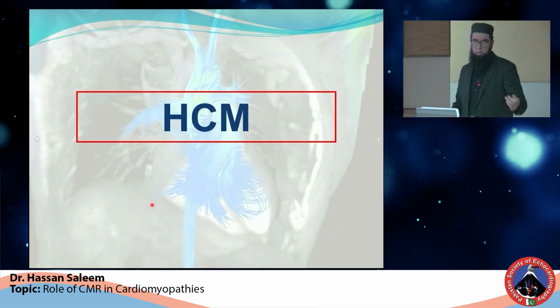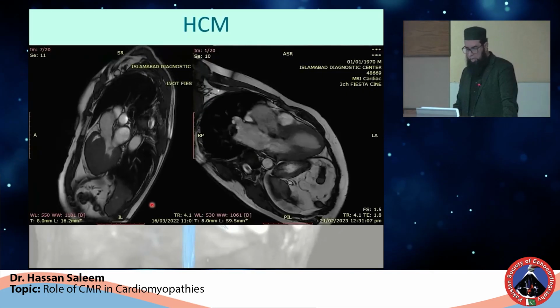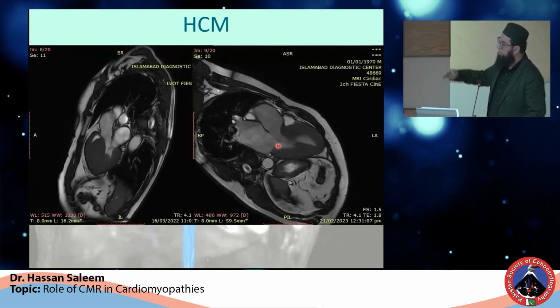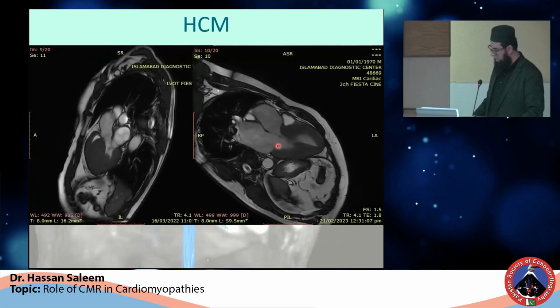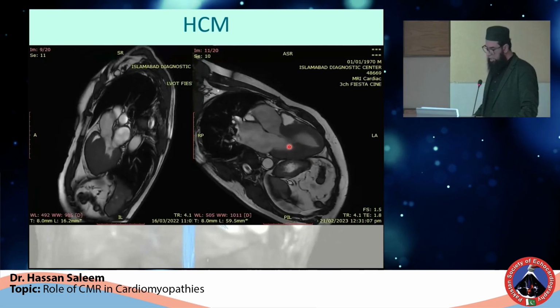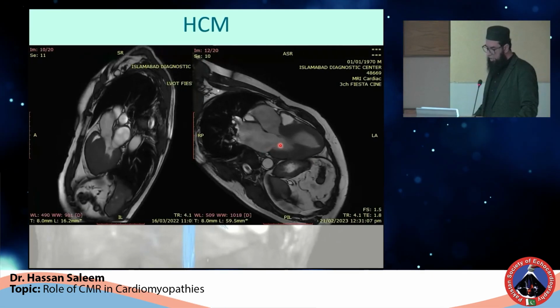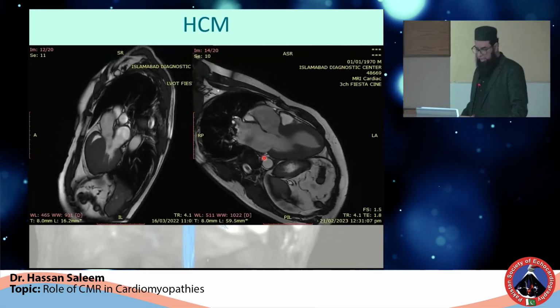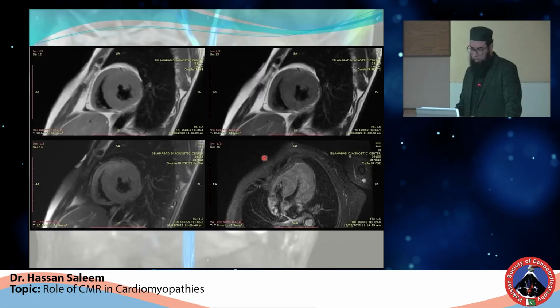We do get, obviously, a lot of HCM patients. Here you can see how nicely you can reproduce the SAM images. You can appreciate the obstruction there, on the LVOT and the jet, which is going into the left atrium. So this is SAM on cardiac MR on three-chamber view.